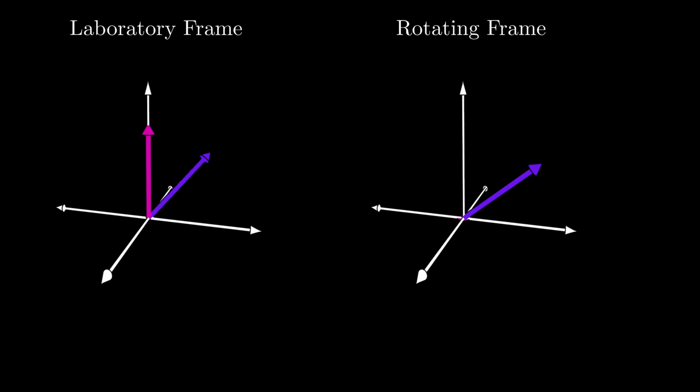Notice how I animated the magnetic field vector in the rotating frame. In this frame, an effective magnetic field must be substituted for the true field strength if we want the Bloch equation to remain valid. The math of the rotating frame will be a topic for a future video. All I want to do here is get you to see the 2 ways I plan to animate spins in this video. Both of these visualizations will be handy to us in learning MRI. The laboratory frame is great for visualizing spin frequencies, and the rotating frame is nice for examining spin phases.